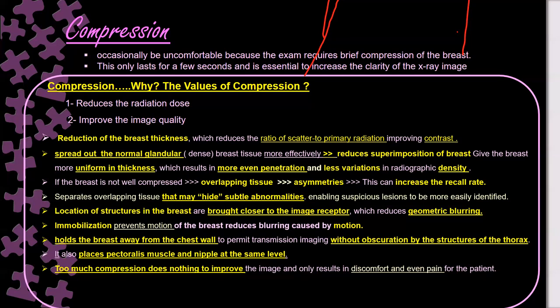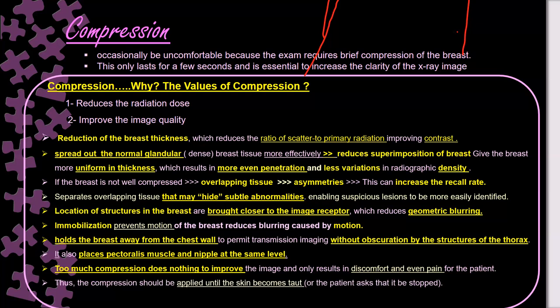And we have to know that too much compression does nothing to improve the image quality and just gives more discomfort and pain to the patients. So only apply compression until the skin becomes taut, or if the patient asks to stop more compression.